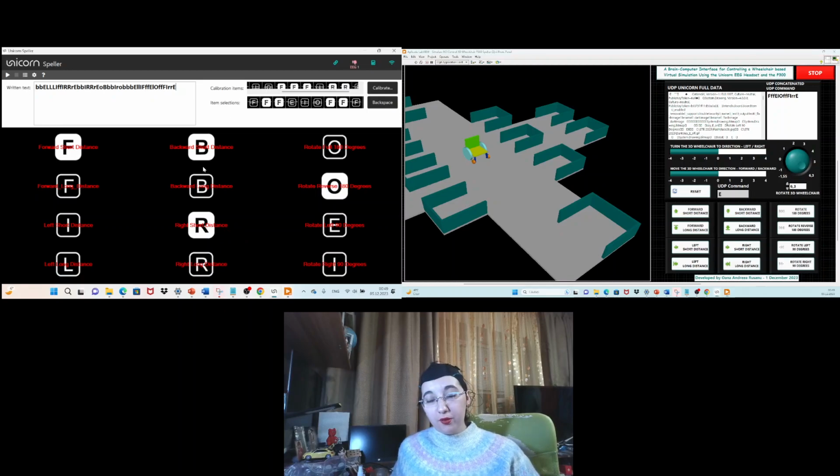Also, I want to inspire you to experiment with the brain computer interface that has a lot of potential in multiple areas, not only in research but also in education, in creativity areas, for artists, for musicians, and also for everyone else.